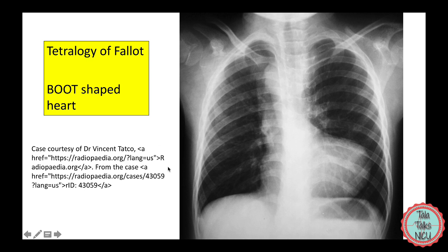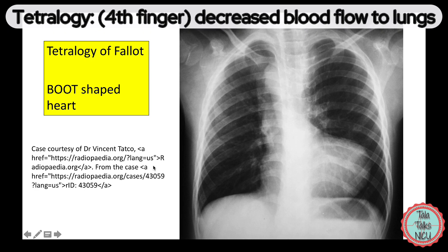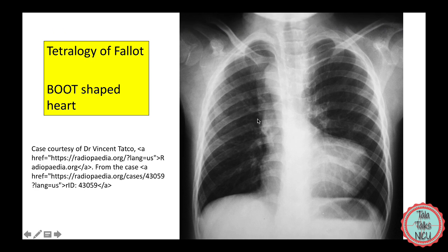Tetralogy of Fallot is number four — it has four features, and this finger is down in 'I love you,' so there is decreased blood flow to the lungs. We'd expect the lungs to be darker, which we do see. Because there's an obstruction to blood leaving the right ventricle, it becomes a bit bigger, making up a large part of this boot shape. Because there's decreased flow through the pulmonary artery, we see a concave area there. That's creating the classic boot-shaped heart. Tetralogy of Fallot probably most commonly actually looks boot-shaped.